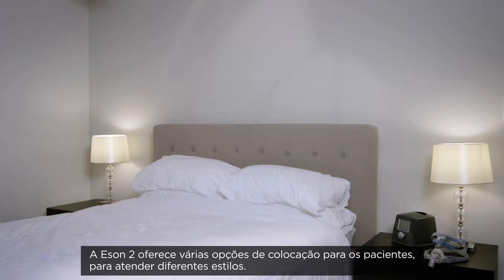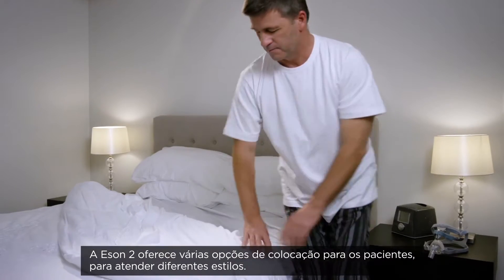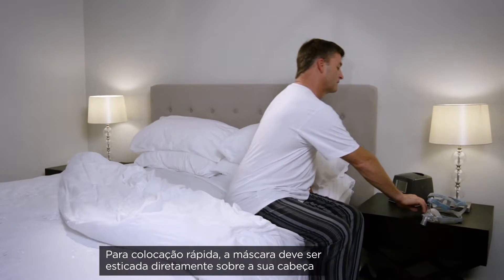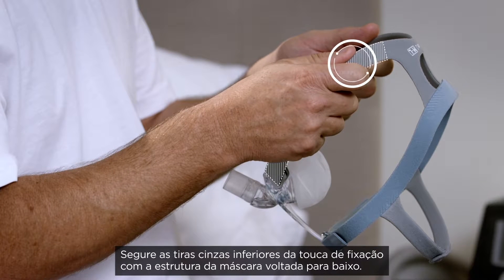Eson II provides multiple fitting options for patients to accommodate a number of different fitting styles. For a quick fit, the mask can be stretched directly over your head. Hold the bottom gray straps of the headgear with the mask frame facing downwards.